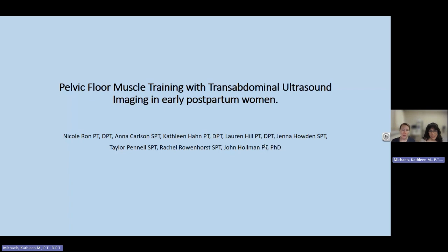We then compared vertical bladder excursion measurements during volitional pelvic floor contraction pre and post training between two groups, those with bladder descent and those with bladder ascent during baseline pelvic floor muscle contractions. There were statistically significant improvements in mean vertical excursion of the bladder base post-training.